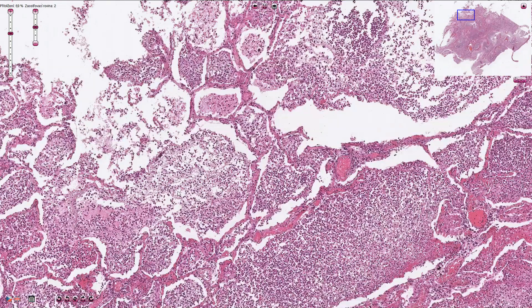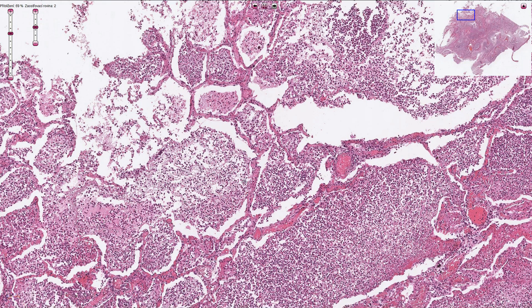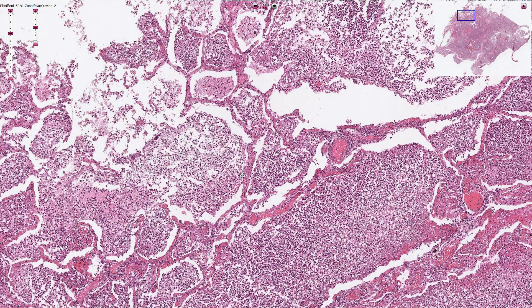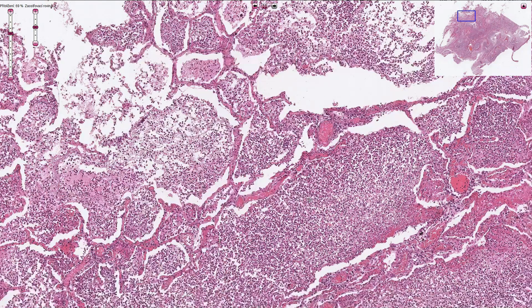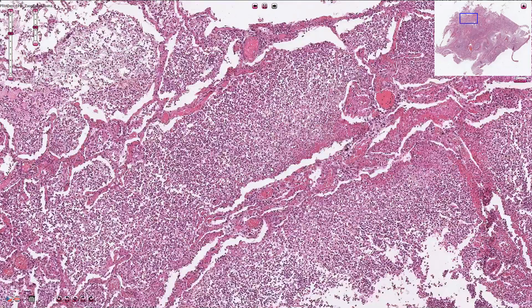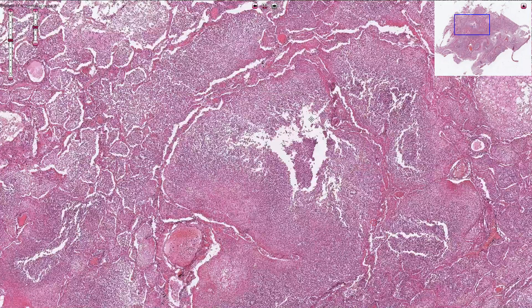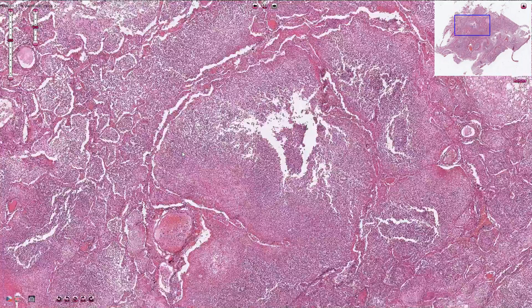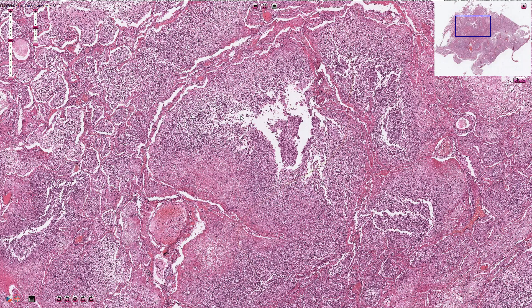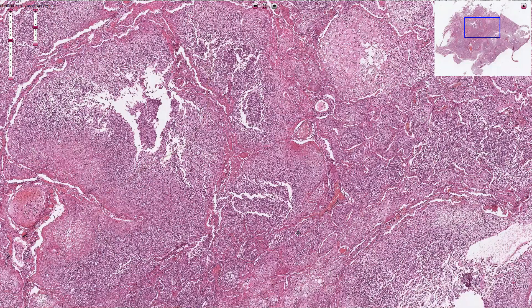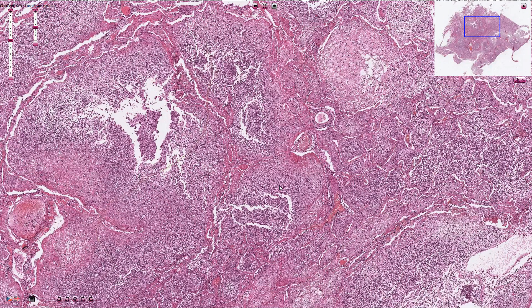If the bacteria is very aggressive, as in the case of Staphylococcus aureus or Pseudomonas infection, we can see destruction of the inter-alveolar septi and the formation of abscesses. This is a large abscess here, and there are other abscesses here and here.